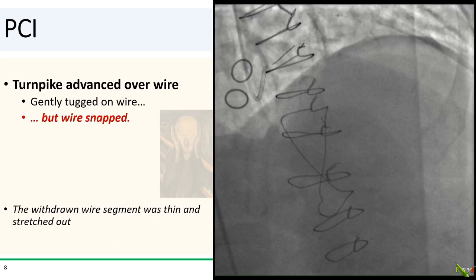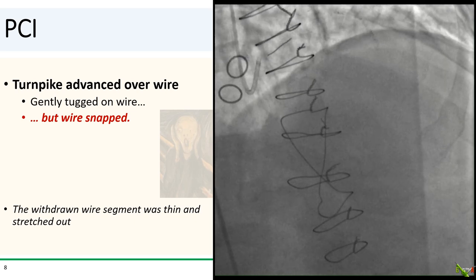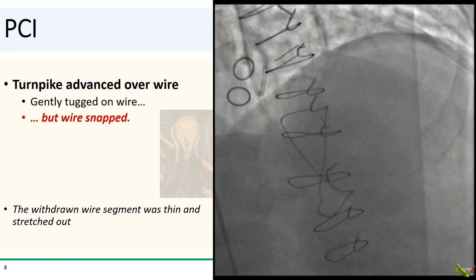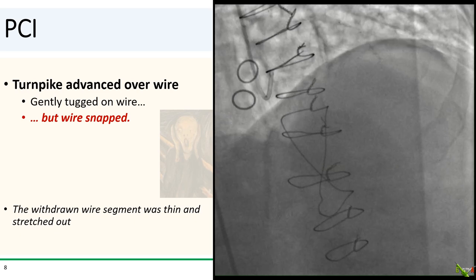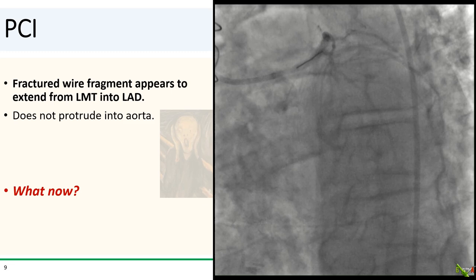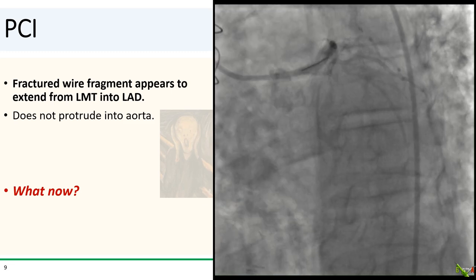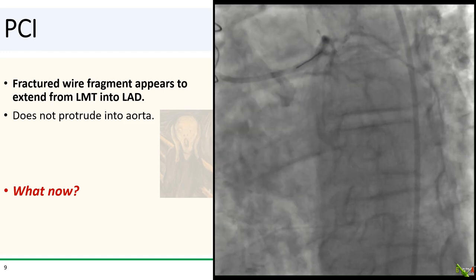We advanced a Turnpike microcatheter over the wire and gently tugged a little bit more, but unfortunately our wire snapped. You can see a cine of the wire fragment in the coronary here. The wire segment that we pulled out was actually quite thin, unraveled, and appeared very much stretched out. The fractured wire fragment appeared to extend from the left main into the LAD.